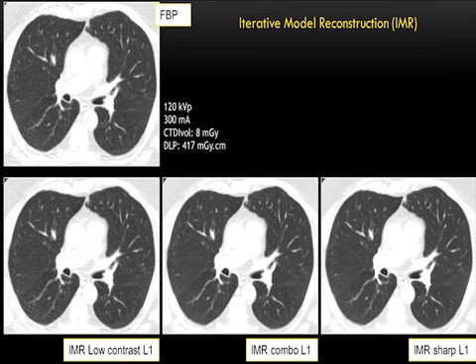If you look at the posterior part of the lung bases, the streak artifacts caused by the vertebral body, with this setting probably they're not disappearing, but over here they're significantly reduced. So the key message here is, again, that it's important to pick the right setting of IR for the desired effect which we want in the image quality.